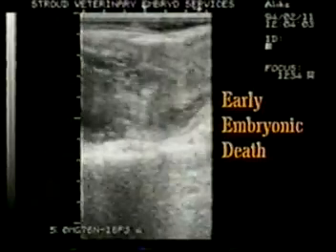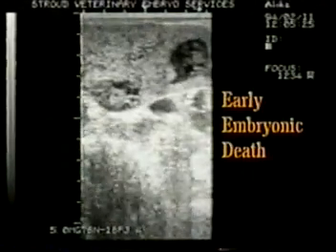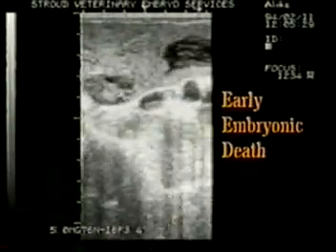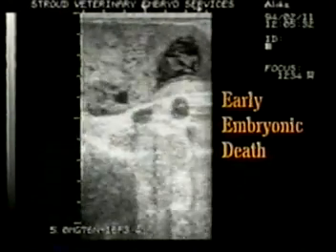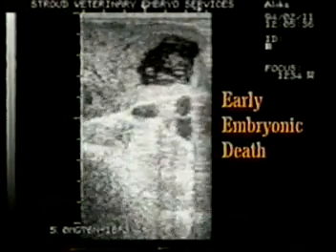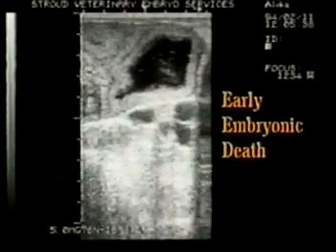The fetus itself is formless in this example, but it should always be examined for a normal heartbeat, as the circulatory system is usually the first ultrasonically observable system to fail in early embryonic death.